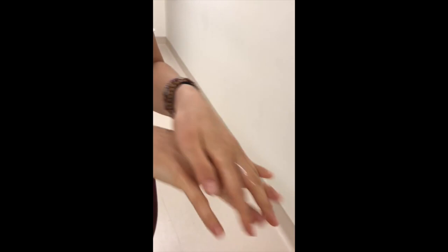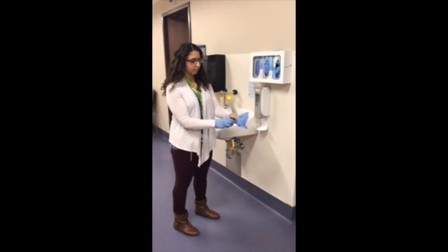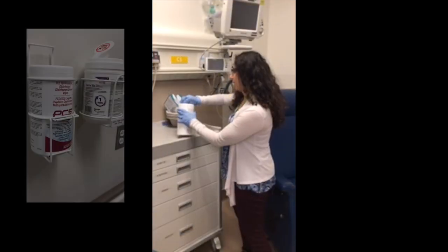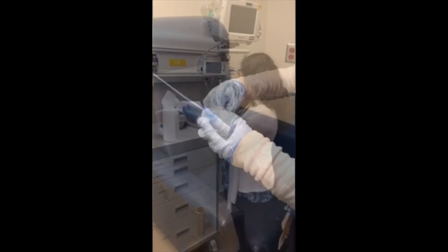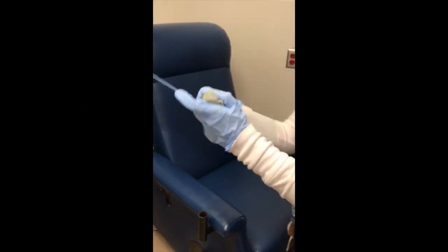Before entering the patient room and putting on gloves, be sure to perform hand hygiene. Then, putting gloves on, clean each piece of equipment following the hospital's patient care equipment cleaning protocol. Taking a PCS 5000 wipe, be sure to apply rigorous pressure when cleaning both the inside and the outside of the pulse oximeter.